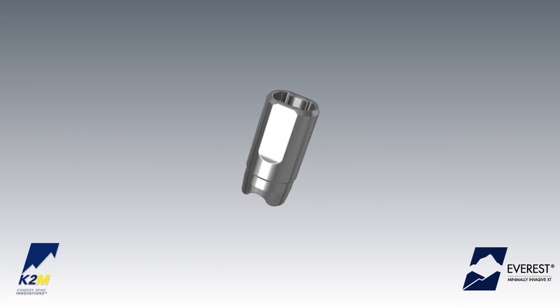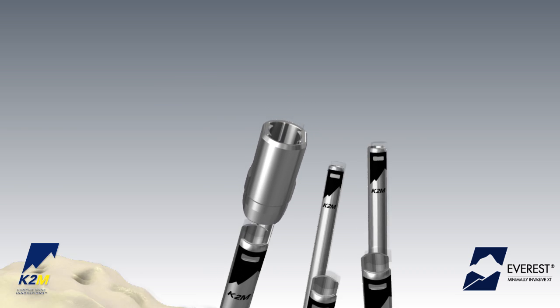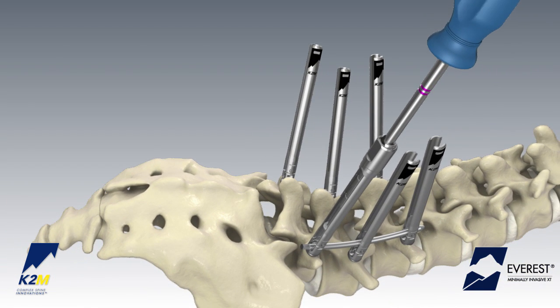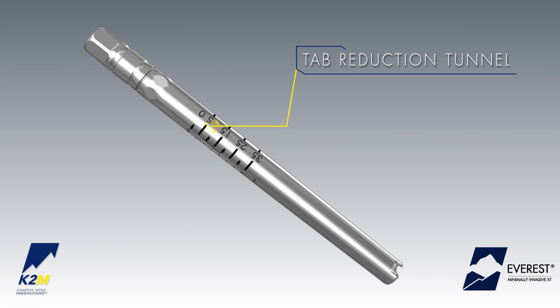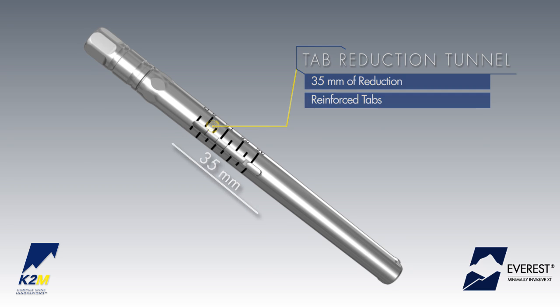For an open-tab construct, use screw caps to facilitate set screw insertion and rod reduction. Place the screw cap on top of the open extension tabs and insert the set screw through the screw cap and down the extension tabs into the implant housing until the rod is secured within the tulip. If more than 25 mm of rod reduction is needed, the tab reduction tunnel may be utilized to provide a total of 35 mm of reduction while simultaneously reinforcing the tab.